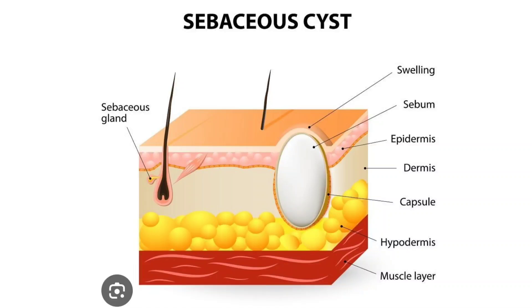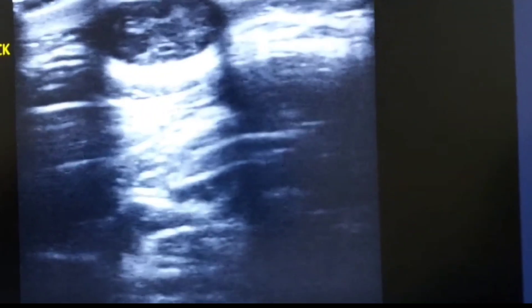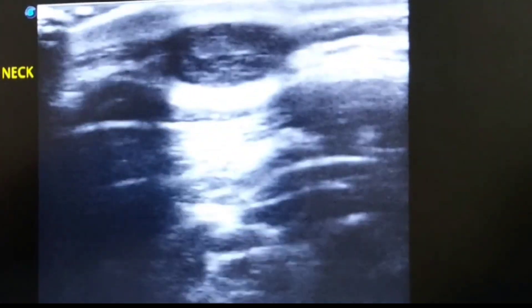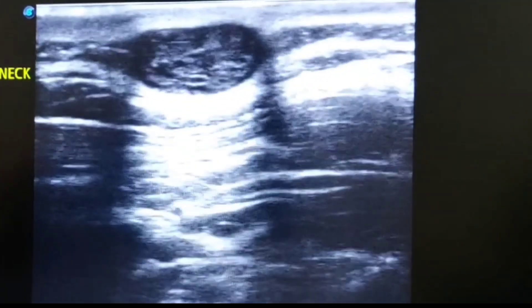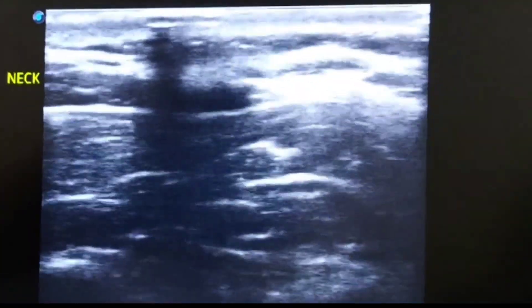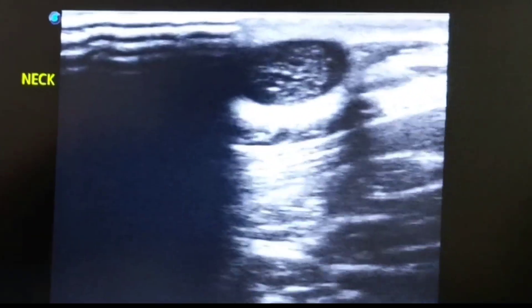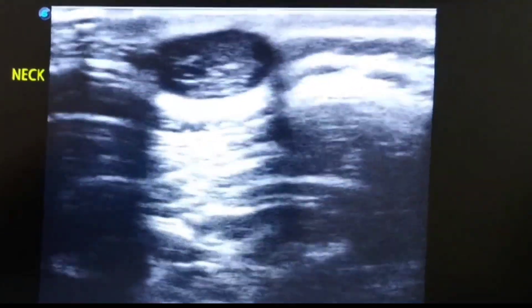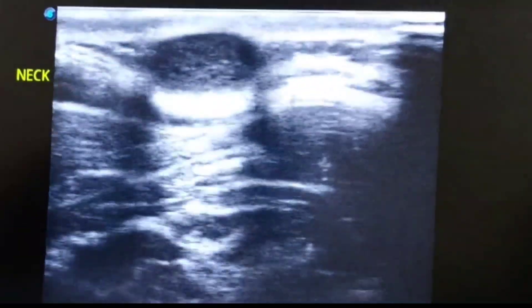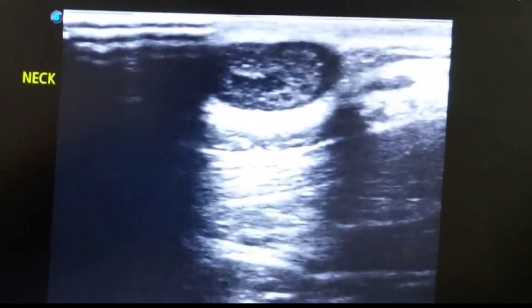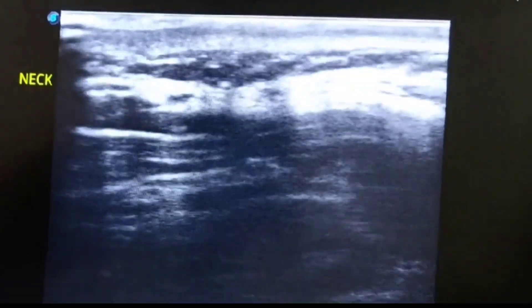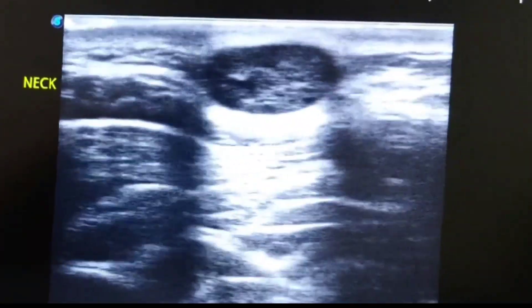The sebaceous cyst is filled with sebum and keratin and protrudes upward towards the epidermis. On high-resolution ultrasound imaging, you can appreciate a well-defined, round, predominantly complex cystic lesion having internal echogenic materials. This echogenicity is because of the presence of sebum and keratin — this is a typical sebaceous cyst.